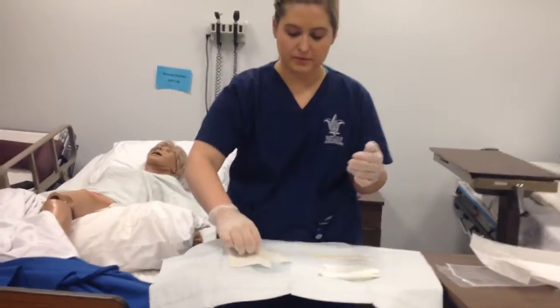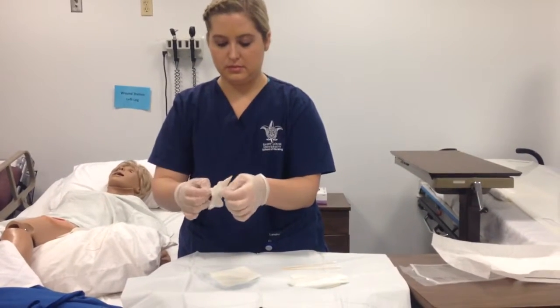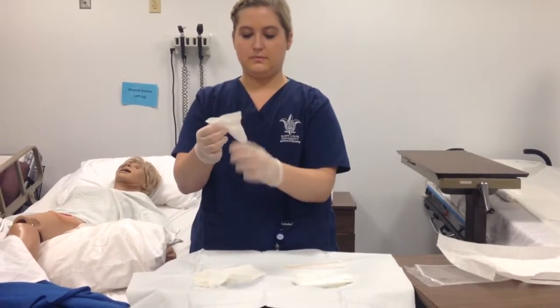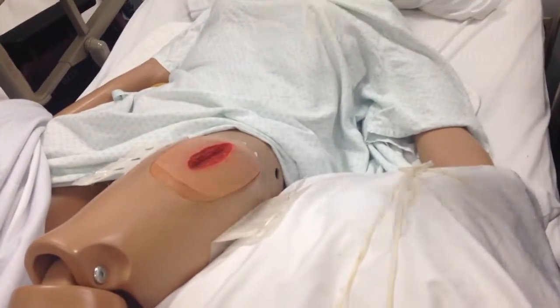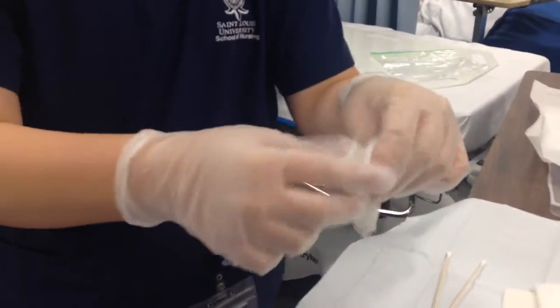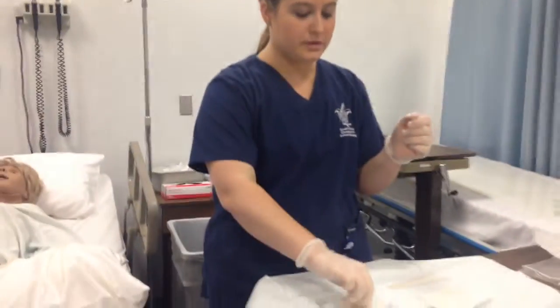I take my 4x4s and I make a little wonton. And then I would clean inside the wound from least dirtiest to dirtiest, and then I would throw this away. And then I would take my other gauze pad and clean the wound on the outside from furthest away to me to closest, and then throw that away as well. And now I'm going to pack the wound.